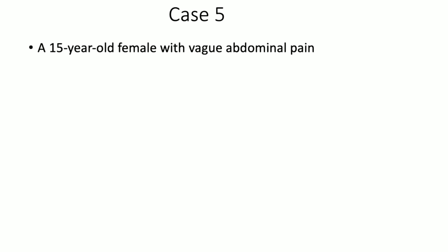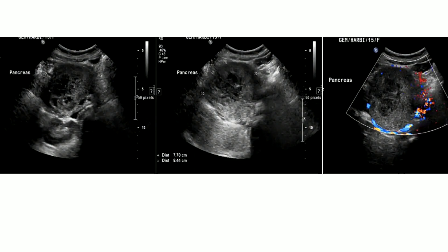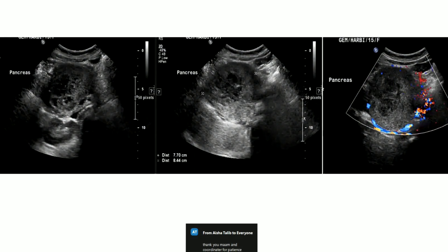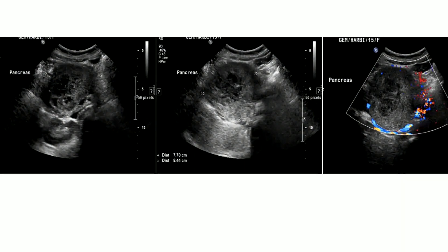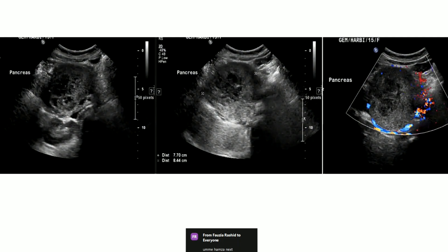A 15-year-old female with vague abdominal pain. I'm provided with three images — two grayscale and one Doppler image in the region of the epigastrium. I can appreciate a well-defined hypoechoic area in the region of the pancreas showing internal anechoic small cystic areas measuring approximately 7.7 to 8.4 centimeters. There is peri-lesional increased vascularity on Doppler without vascularity within the lesion. No significant surrounding fluid, and no calcifications are appreciated.